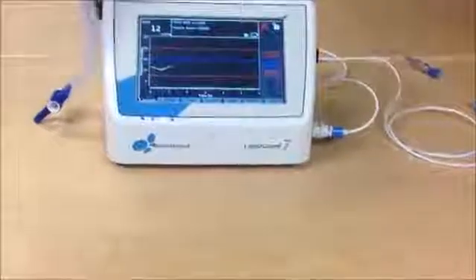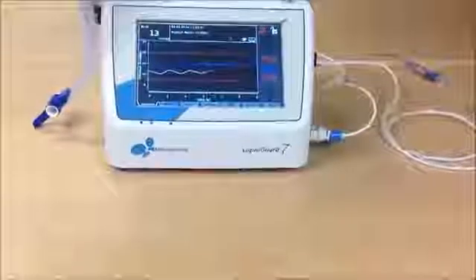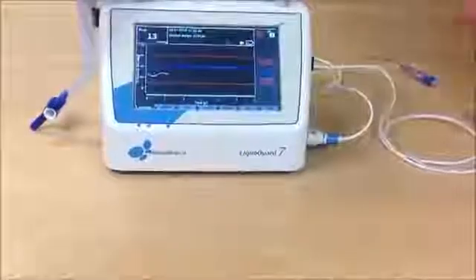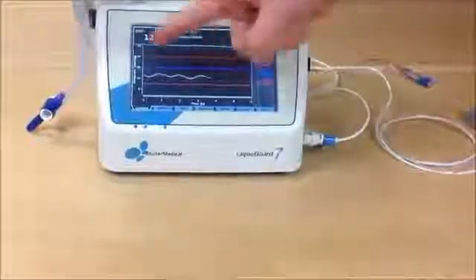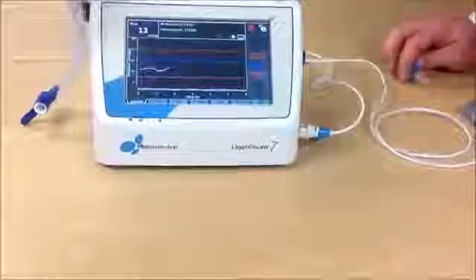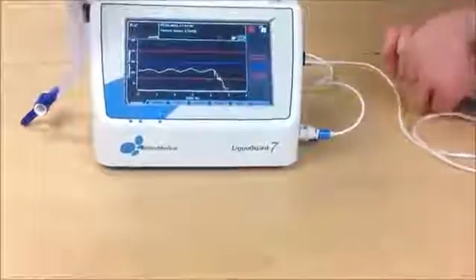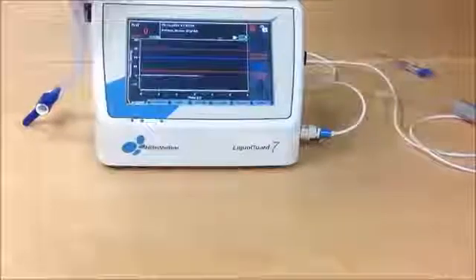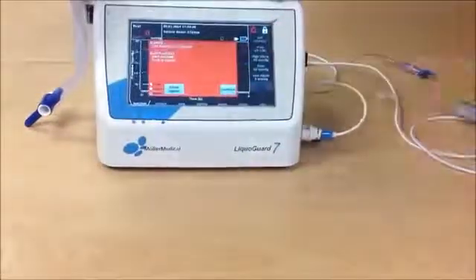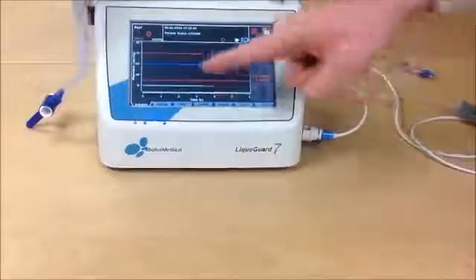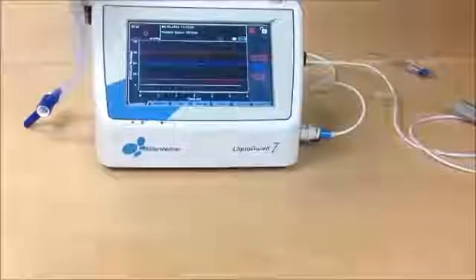Likvogart also detects disconnection of the tube set. In this situation, everything is okay. We see a pulsating pressure. When I now disconnect the tube set from the patient, we will have two alarms telling us that we have a problem. First, we have a low pressure alarm, because we are below the lower red alarm border.